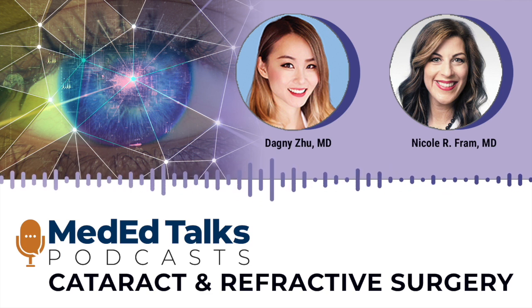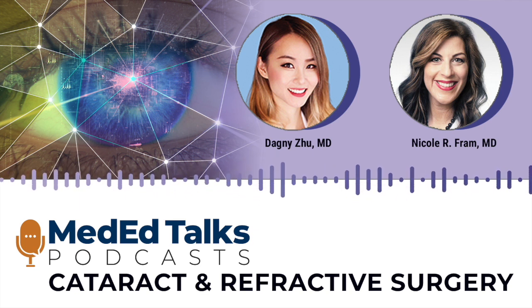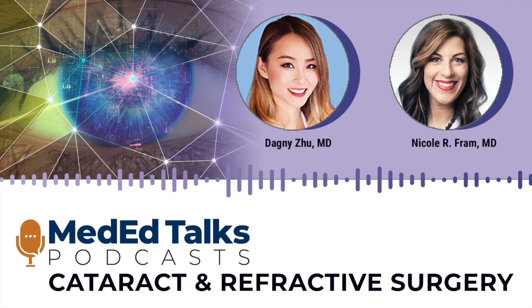We have that with the light adjustable lens, but also the perfect lens, being able to take people who weren't on target and change their lens after surgery, provided that the contrast sensitivity and MTFs remain. That's a technology that I'm excited about. I think we have a lot of interesting and amazing technology as it stands right now, but my biggest excitement is really about adjustability in the future.